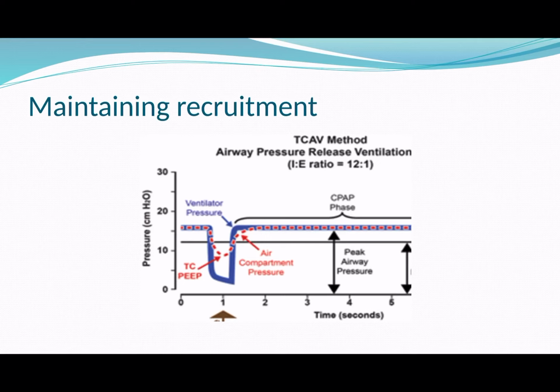And the way to think about that is if you're driving a car, you've put the accelerator to the floor and you're accelerating as hard as you can. That's your P high level, and you're accelerating. And then what you're doing with the P low is you're telling the accelerator to come right off.